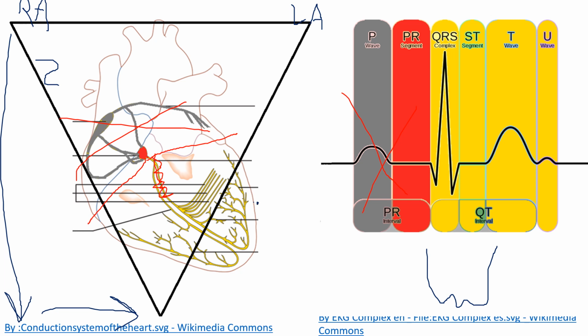Well, I'll change color here for clarity. If I start over here, I'm going to my patient's right. That's not normal. That's going to be like a negative right there. My heart's electricity is also going up and also going down, and these are going to cancel each other out. And so I'm going to get a negative voltage because my heart's electricity is going the wrong way.